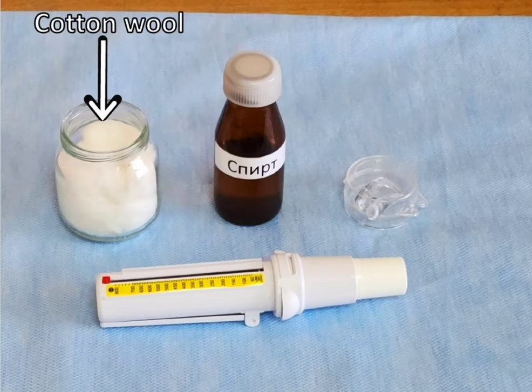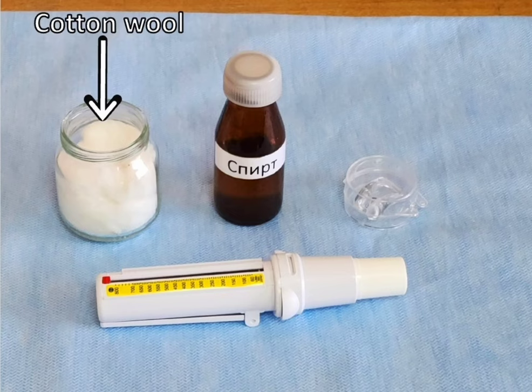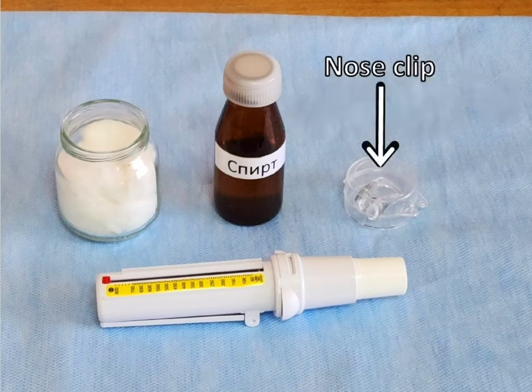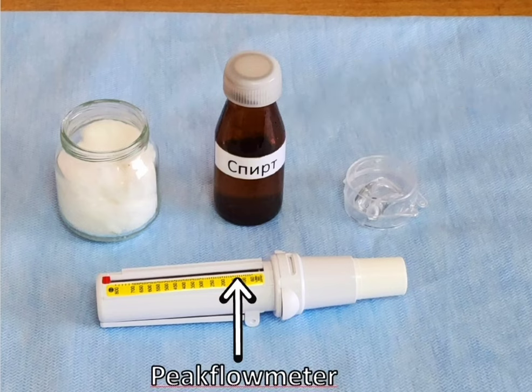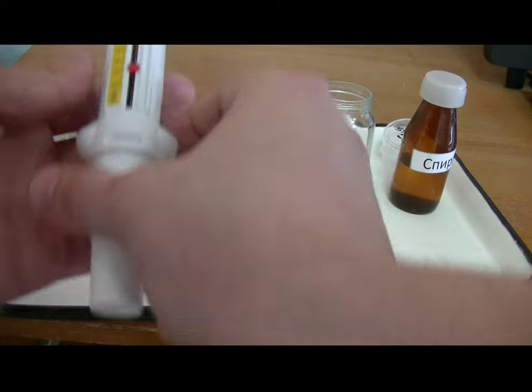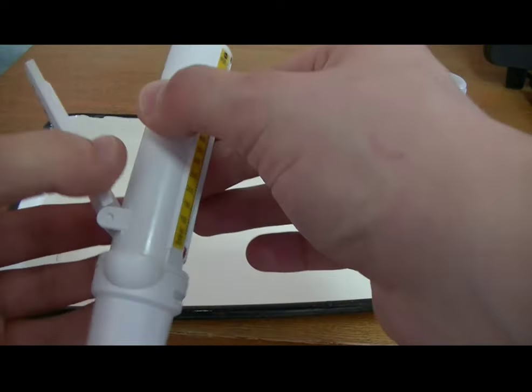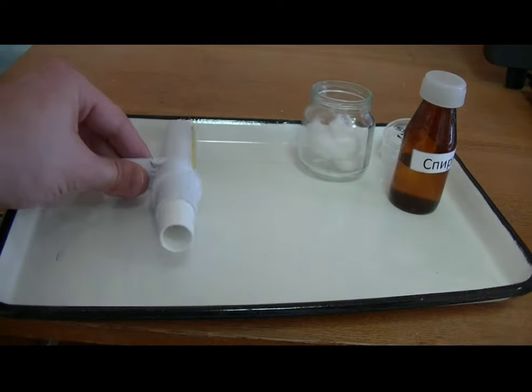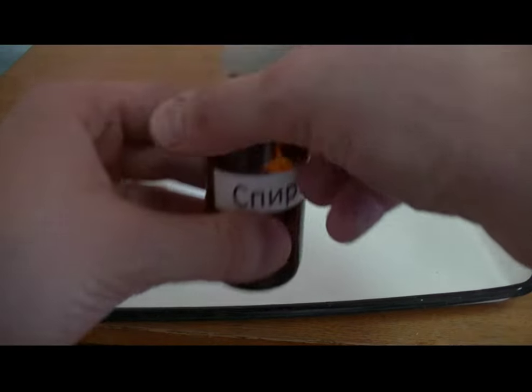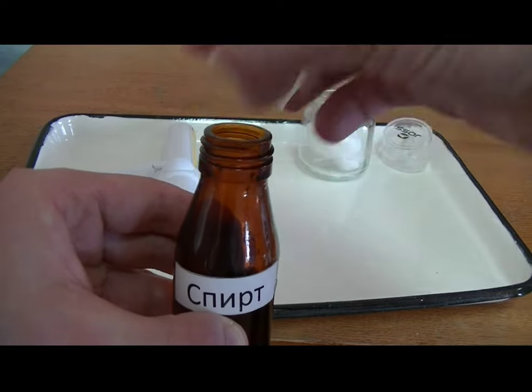For this method you will need: cotton wool, medical alcohol, a nose clip, and a peak flow meter. Begin by informing the patient about conducting the peak flow measurement. Attach the mouthpiece to the peak flow meter, then disinfect the peak flow meter.